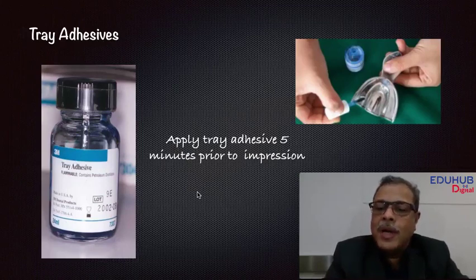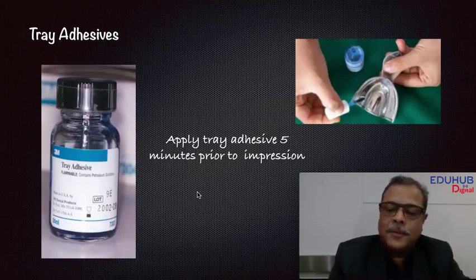At least 3 to 5 minutes before is recommended. So selection of your tray and putting on a tray adhesive is very, very important. Most people are usually in a hurry and they forget to put the adhesive. So it's always important that you place this adhesive several minutes before you actually load the tray. So tray selection also means placing adhesives.